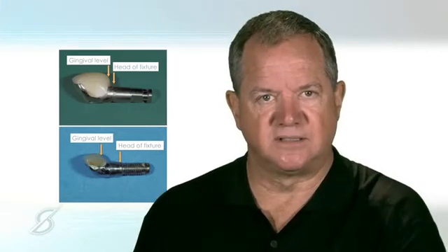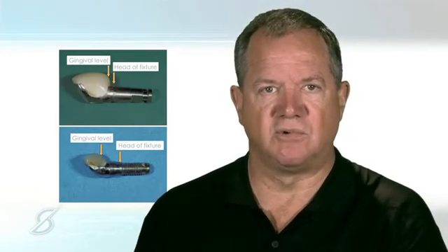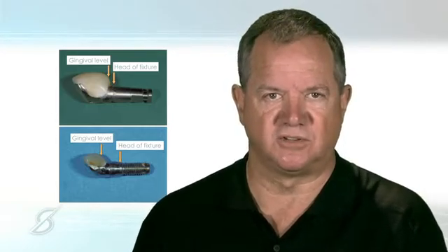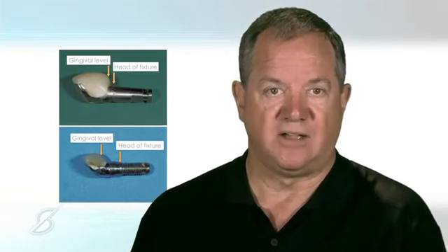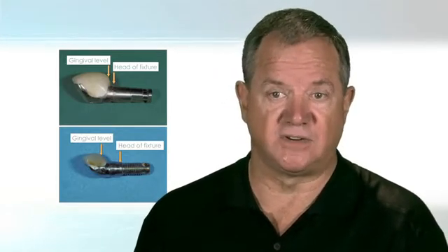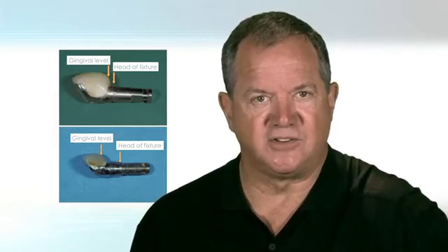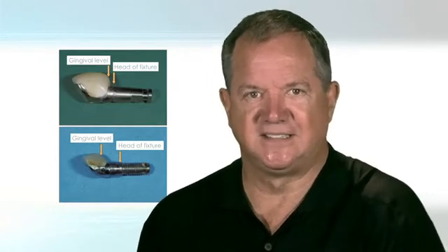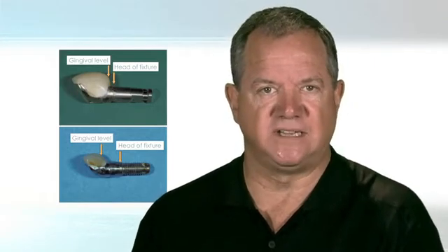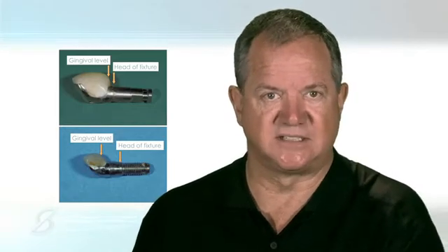And once it's to place, I send the patient away. I very, very rarely take any tissue away when I'm tissue molding. I let the pressure of the restoration redistribute the location of the tissue. Now, when you are doing tissue molding, think about how difficult it would be to try it with a cement retained restoration, where you put an abutment in and now you try and push this into the tissue. So that's why almost all of my temporaries are always screw retained, is they allow me to create a contour I want and the screw will seat it to place.